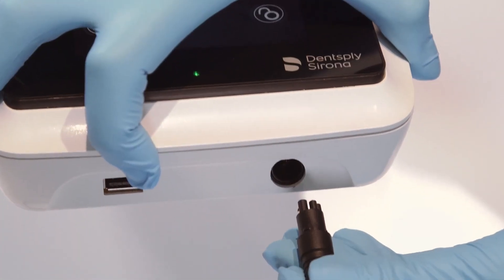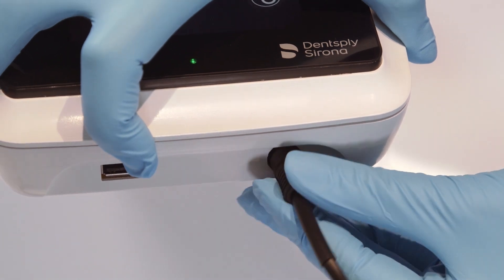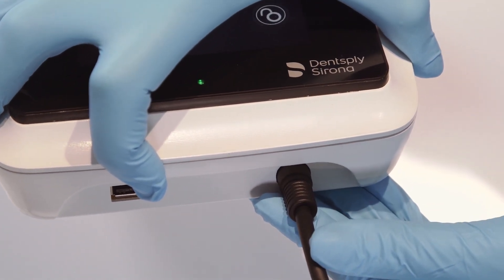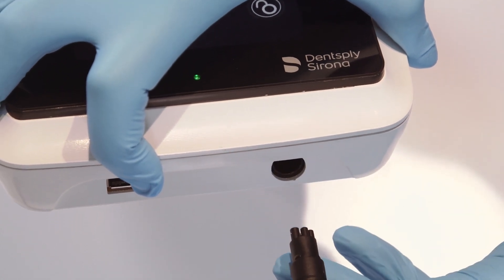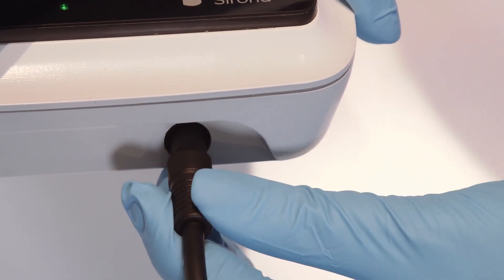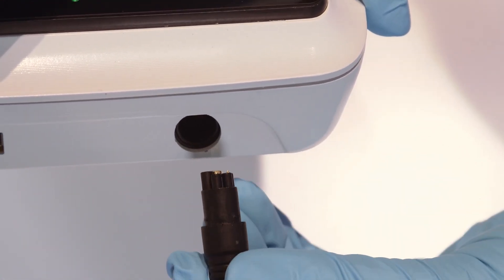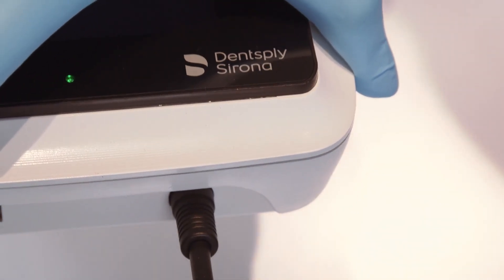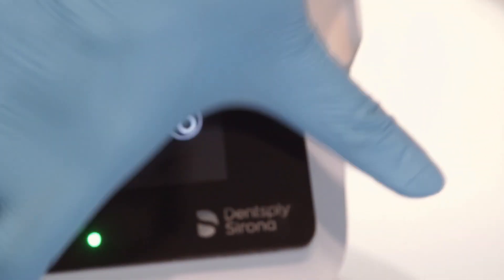To connect the featherweight handpiece cable to the Cavitron 300 series ultrasonic scaling system, insert the black handpiece cable connector into the port on the front of the system. If the cable connector does not seat into the system's port, gently rotate the cable connector until contacts align and then fully insert the connector.